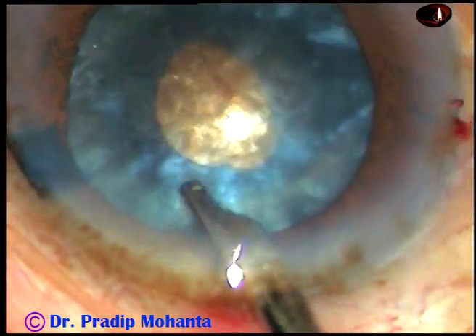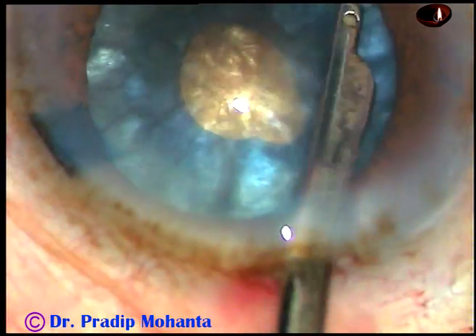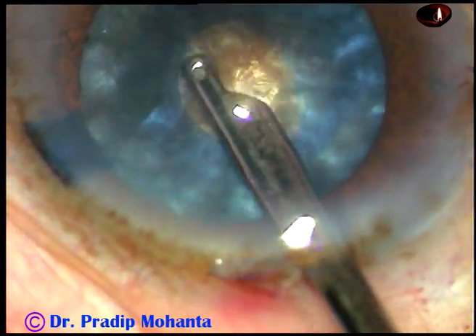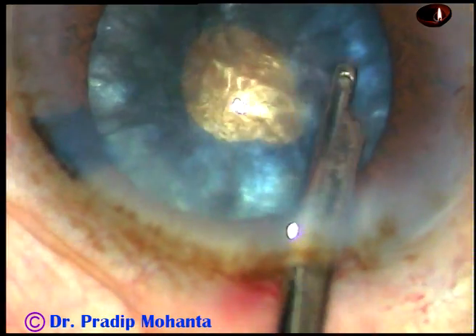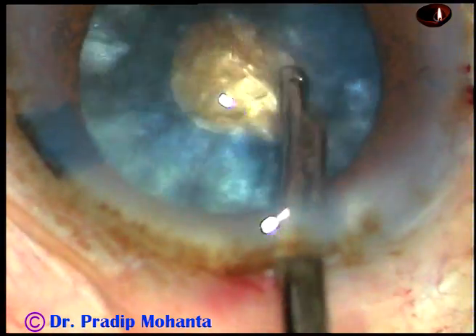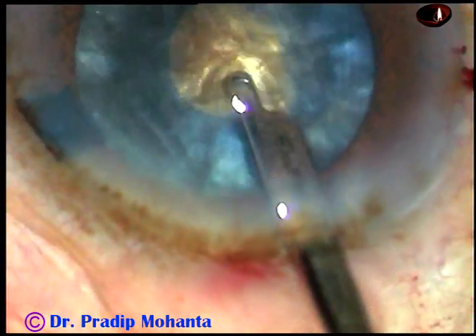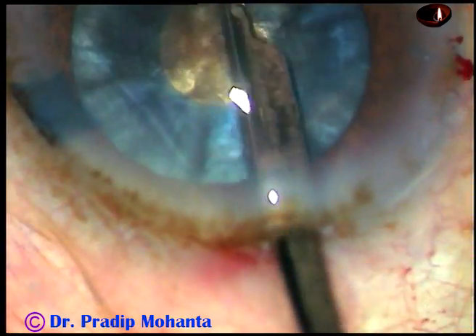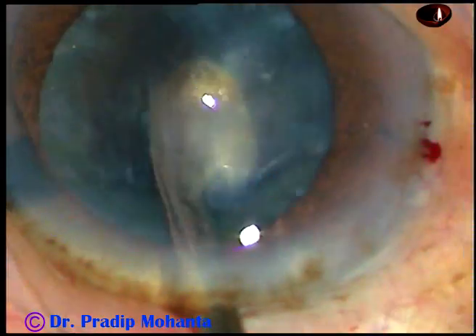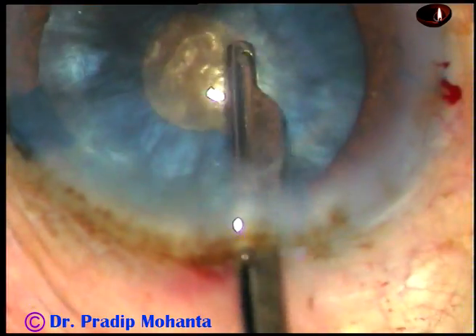Bring the cortex from the periphery and then aspirate it. You can see there is a huge hard brown nucleus. The capsular bag has been decompressed. Intralenticular pressure has been reduced. And the shrew has been tamed.